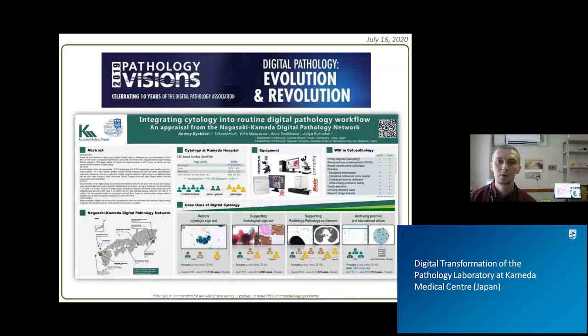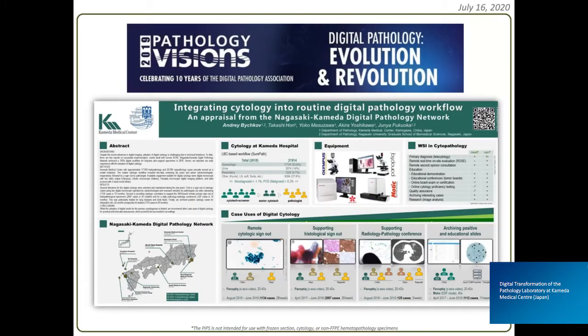Just one slide to show that we are also able to do digital cytology. Probably Philips is not the one actively employed for that, but we were able to use other vendors, and we use this digital cytology information to integrate with histopathology to make the correct diagnosis, and also to do research.